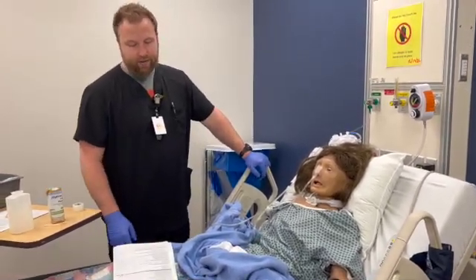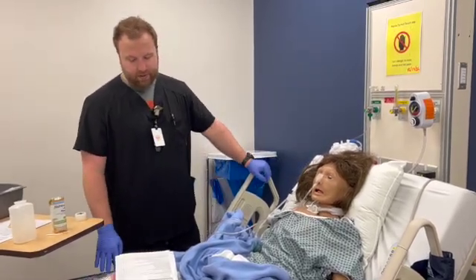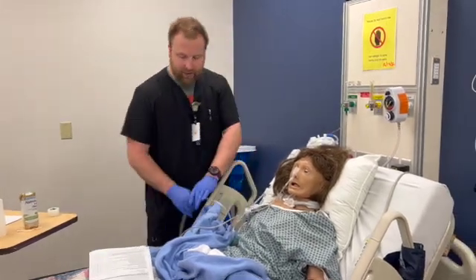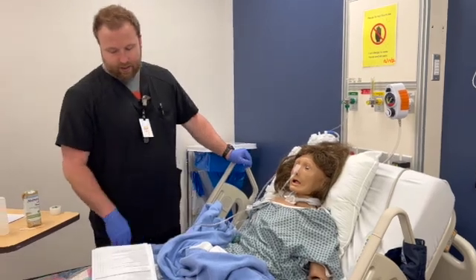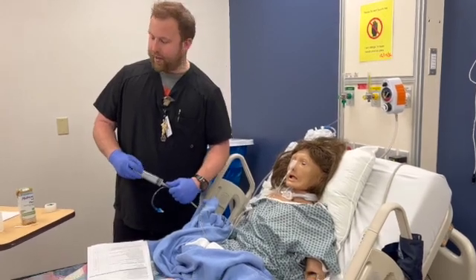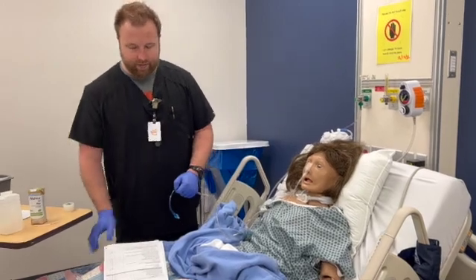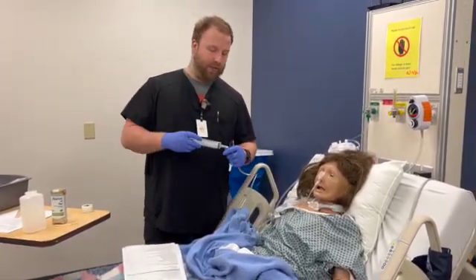Now, I want to elevate the bed 30 degrees or higher. We're still up from the NG tube insertion, so this will work. We will discontinue our suctioning because we don't want to suction all the tube feeding back out. We will verify tube placement. We will pull this out here, get our stomach contents, checking the pH. It is verified. If this is not your first tube feeding, you will check for residual.